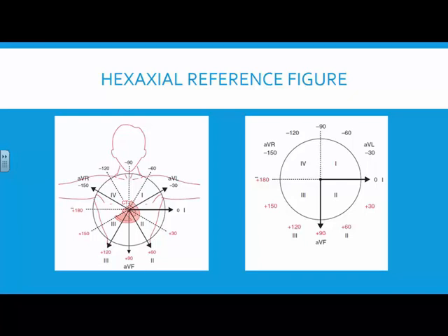Now, you're talking about the closer it gets, the bigger the deflection is. Now's the time when you can think about that because in reference to everything else, it is closer to that positive, right? So we've got that R wave. That R wave then turns into a S wave, and your S wave is your what? It's negative, right? So what's happening? It's actually going retrograde to get the rest of the ventricle, right? So that's why it shows as a rapid negative.